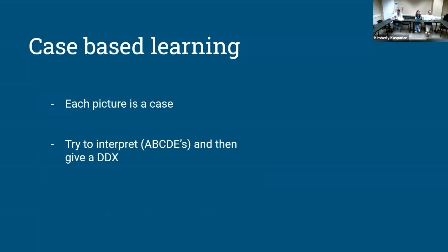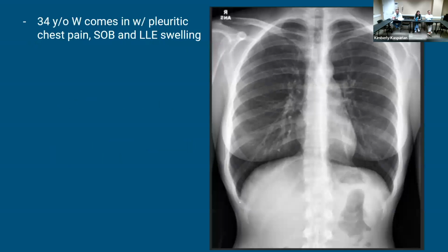So that being said, do y'all have any questions about this very brief intro before we do cases? Okay. I figured I wanted to be quick with it since y'all read chest X-rays all the time. There are probably about 10 or 12 cases. Each one is a picture with a clinical vignette. Y'all just participate, or we can call on people and single you out. All I want you to do is describe the chest X-ray, think about the wording you would use, and then give a differential or the diagnosis, saying this is what I think it is based on that. That way it'll stick with you, you can see it again, and it builds repetition memory.